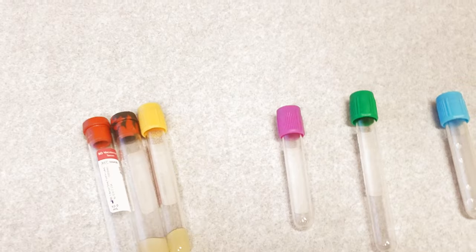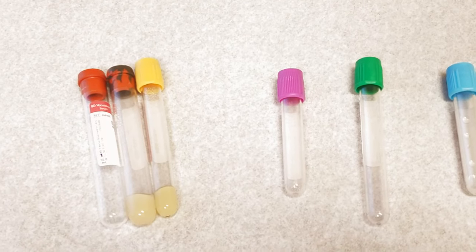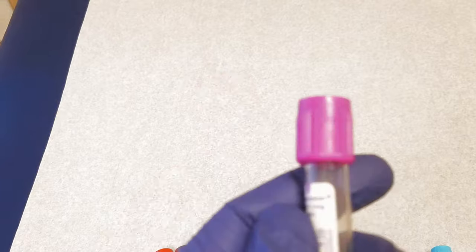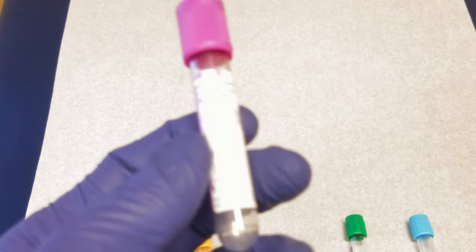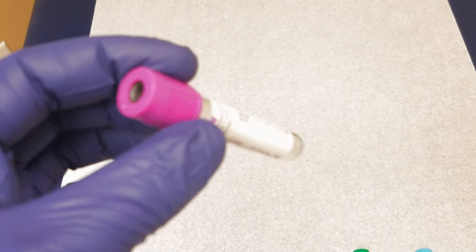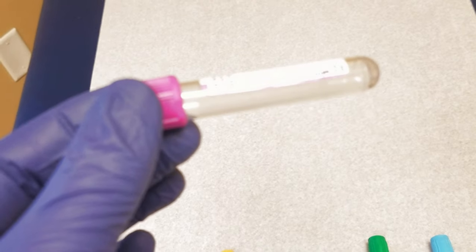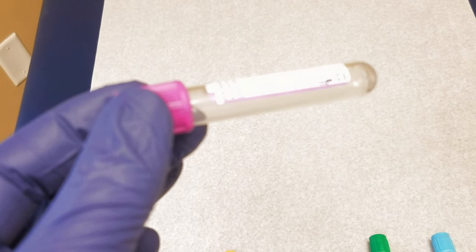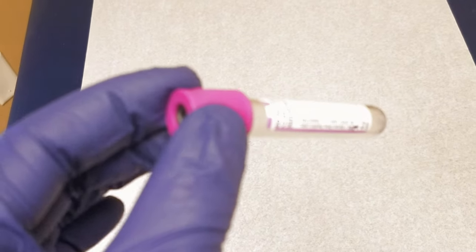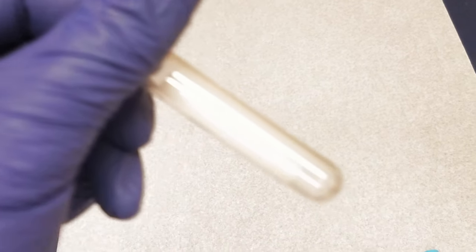For whole blood tests — like hemoglobin A1c, complete blood count, peripheral smear, or some genetic tests — you use a lavender tube. The lavender tube contains EDTA, which prevents the blood from clotting. You can mix the tube and do a whole blood test, or you might have a plasma test, which is similar to serum except the clotting factors are still present in plasma. You spin it down and draw off the top layer of plasma, separate from the blood cells.